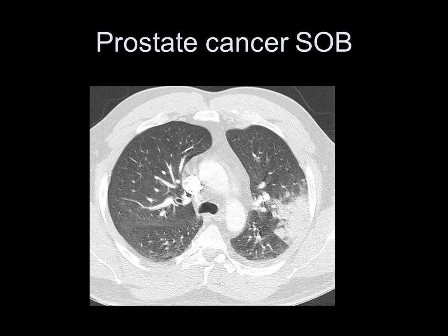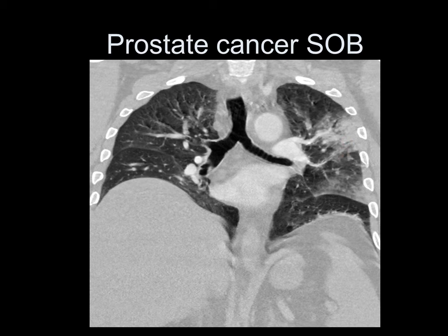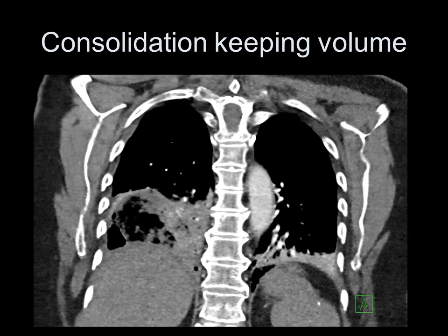Here's a patient with prostate cancer who's short of breath. There's an irregular margin to the abnormality, and there is volume preservation in this area of opacification — this is consolidation. Nowadays we're able to reconstruct our images as we wish, and you can get a better impression of whether there's volume loss by doing so. We have standard reconstructions in the coronal and sagittal planes, so there's no excuse not to look. We can see the volume is preserved and there are nice air bronchograms.